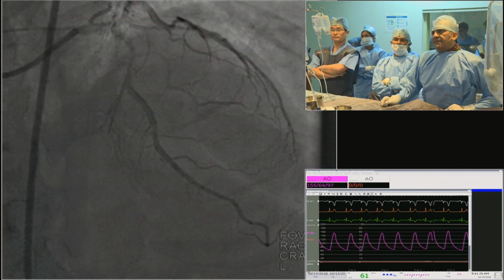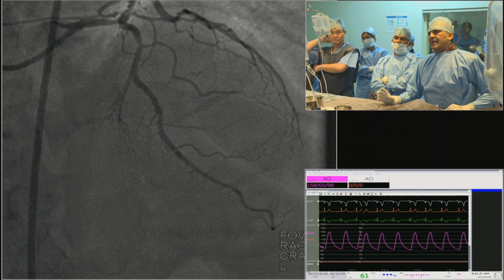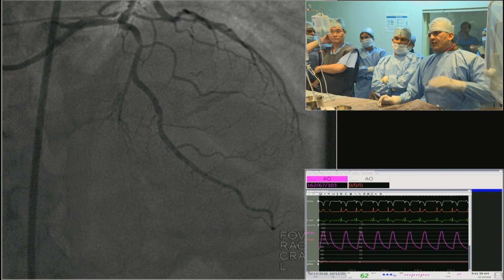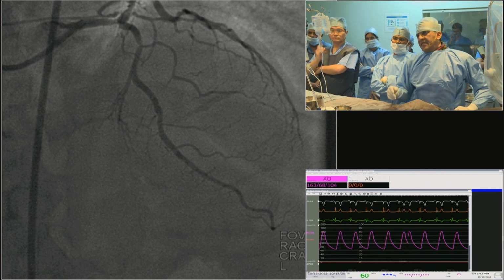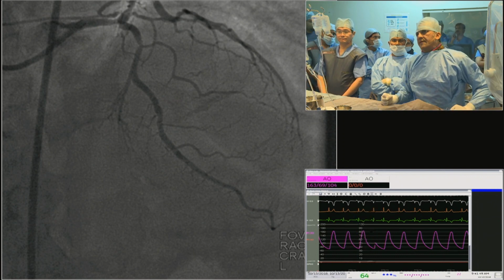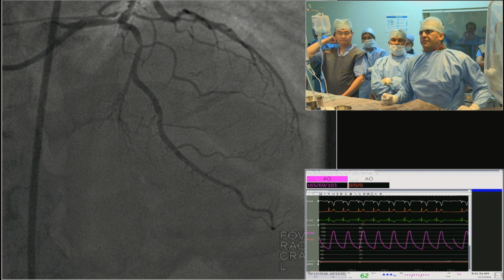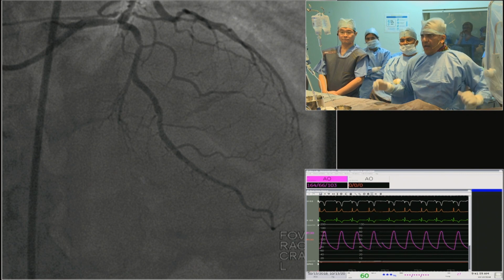So here we have this little less opaque lesion at the level of that diagonal branch in the proximal LAD, and then follows the septal branch, and then you have a very insignificant plaque in that mid-distal LAD area. But our question was, how do we address this coronary angiography with respect to the angioplasty done to the RCA with the patent stent now? Are there any ideas?